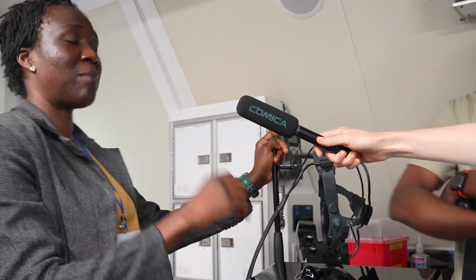This is more like an indirect ophthalmoscope simulation setup. So you get the opportunity to see the retina all the way to the ora serrata. Usually in clinical practice, sometimes seeing the ora can be difficult. So once you get your hands on how far back or forward to move, it helps you to see the ora in actual clinical practice. So yeah, it's very useful.